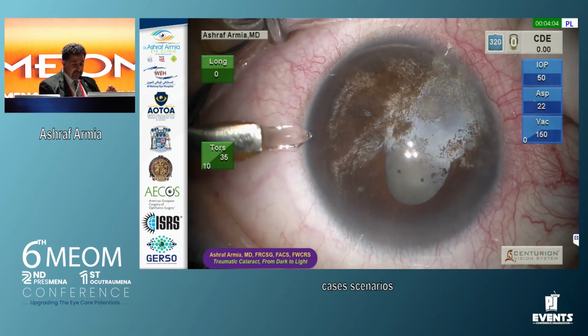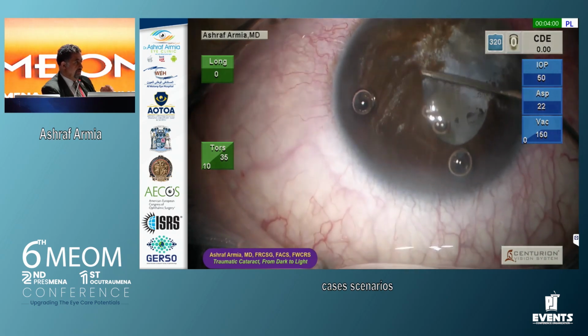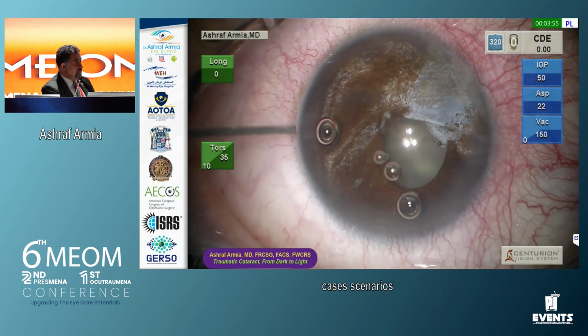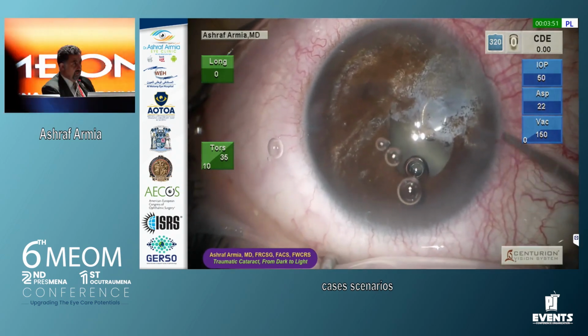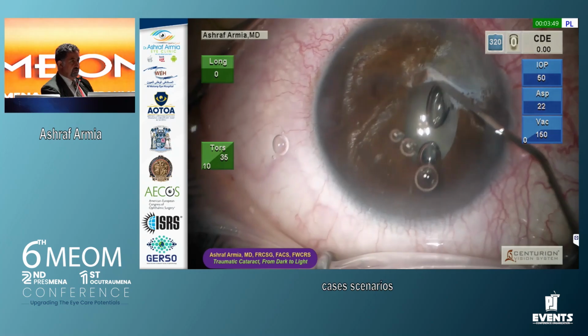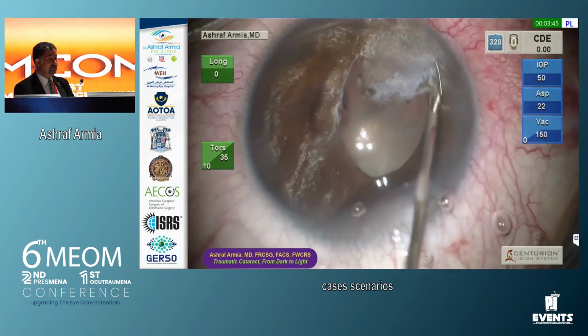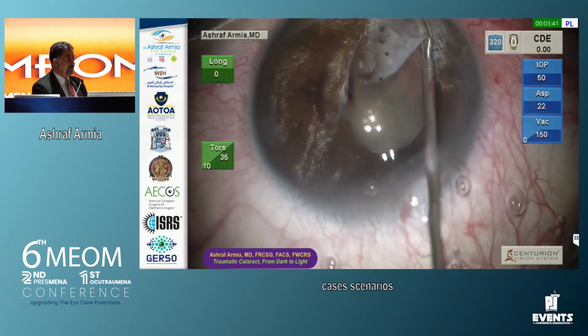In these cases it is very crucial that you plan your surgery and plan your openings in the anterior chamber. We have nearly 1/3 of the iris lost, and we should repair. But these cases with long-term duration iris atrophy need a special instrument inside the eye.